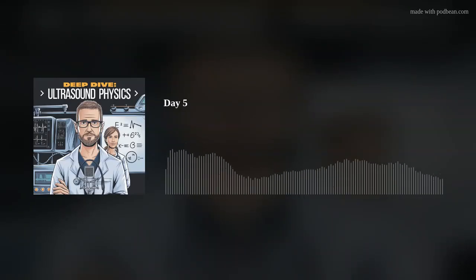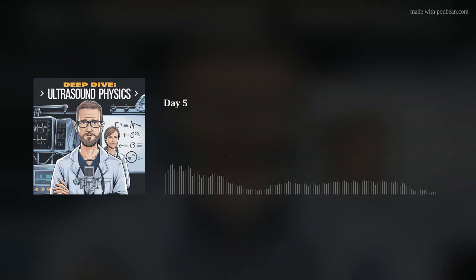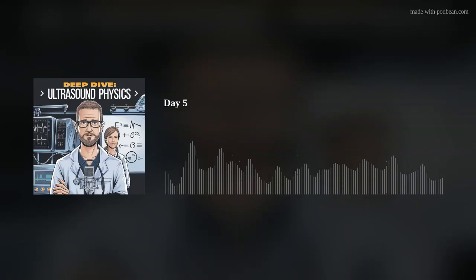And when we look at the detailed information, like from pulsed wave, we talk about the Doppler spectrum. So what's the significance of that spectrum, and why is its timing so important? The spectrum is packed with information. It doesn't just give you an average speed. It shows the whole range of velocities present in the sample volume at any given moment. So you can see if the flow is smooth or turbulent, things like that. Precisely. And the timing is critical because blood flow changes dramatically throughout the heartbeat. The spectrum shows you those changes, tied directly to systole and diastole, the phases of the cardiac cycle. Understanding that timing lets you figure out if the flow pattern is normal or if something's wrong. It's crucial for interpretation. Makes sense.